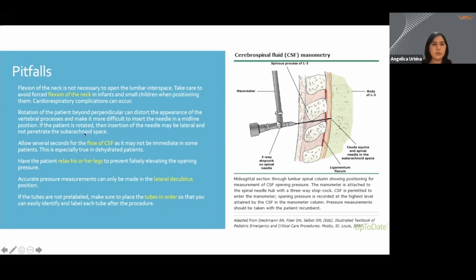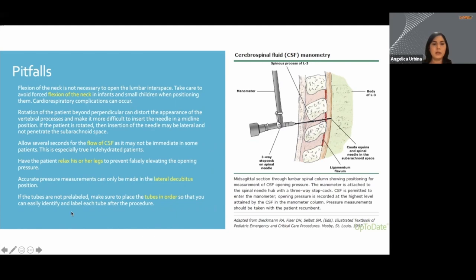Give the CSF a couple of seconds to flow when you remove your stylet — it doesn't always happen immediately. When acquiring an opening pressure, do this when the patient is in lateral recumbent position to get an accurate measurement, and have the patient relax their legs at that point. Lastly, order your tubes. When setting up your supplies on your tray, put your tubes in order so you can easily identify and label them after the procedure.